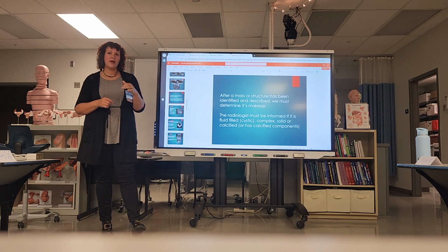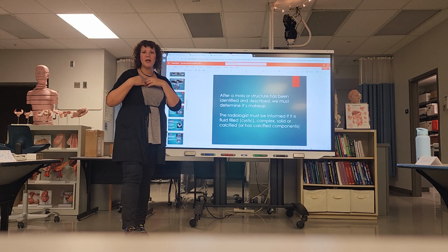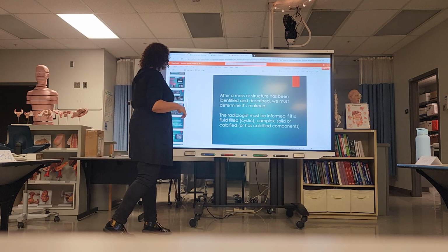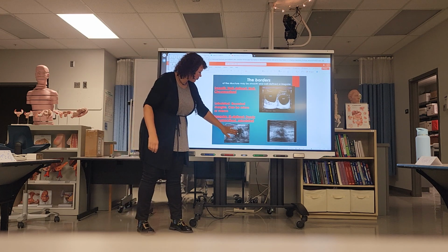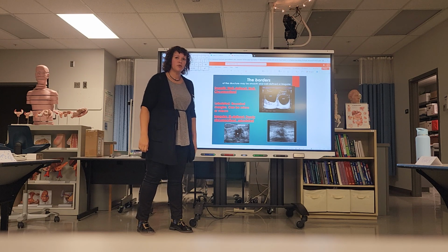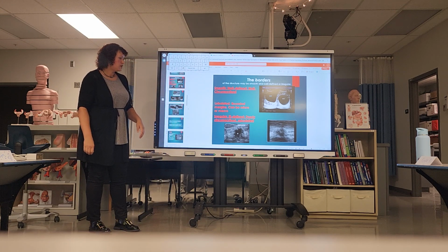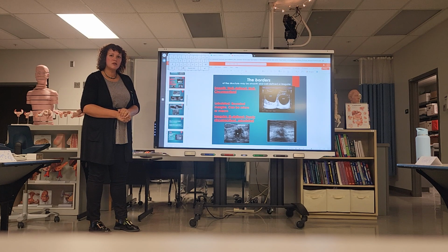Sometimes a hypoechoic mass will shadow, it just depends on how dense it is. Sometimes structures like breast cancer are so dense they will create shadowing posterior to them. So it's not always an echogenic structure that shadows, but most of the time it will.